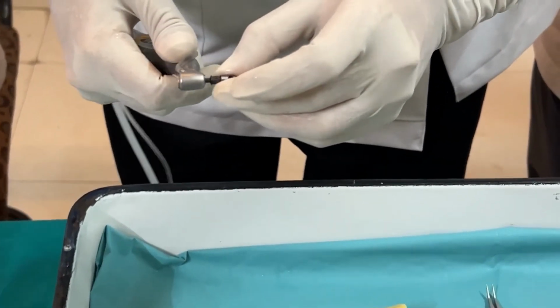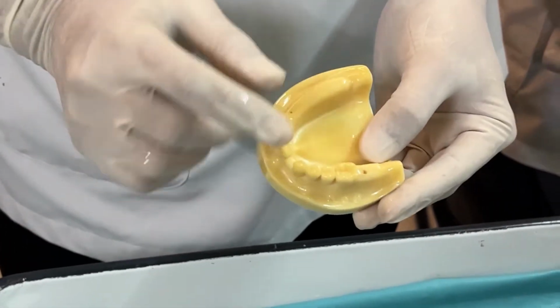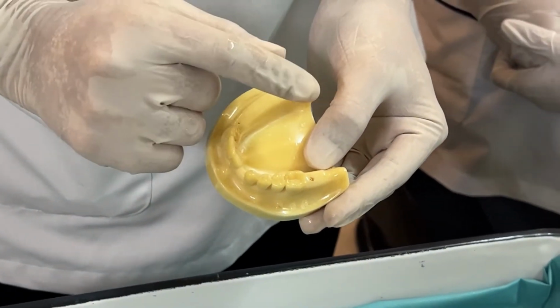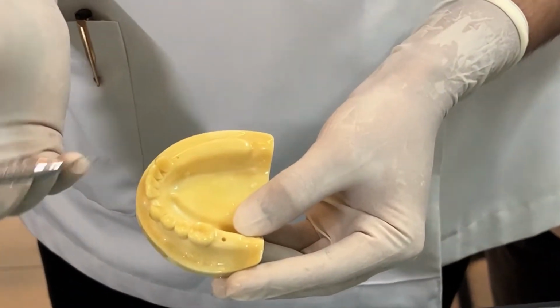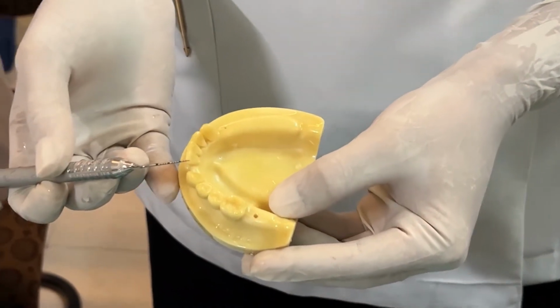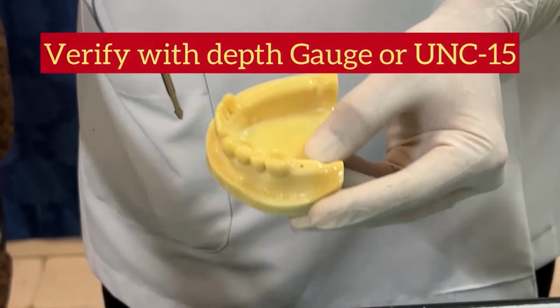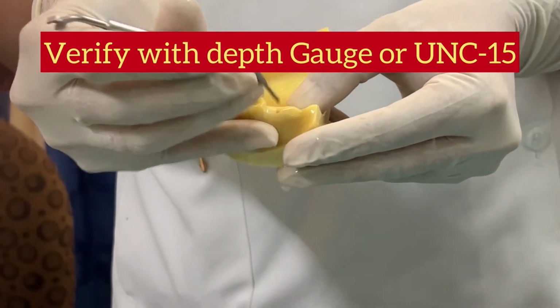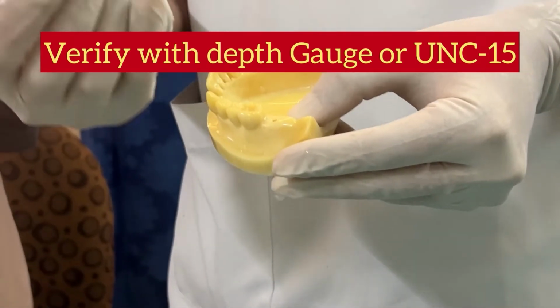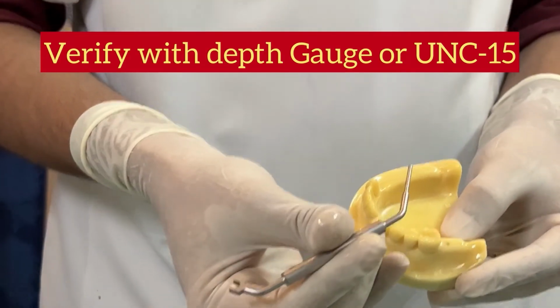So once you have made the initial depth, since I told that the remaining drills are only and only side cutting, always and always verify the initial depth with the 2 millimeter or 2.4. For that you can use a depth gauge also. Many a times the depth gauge would be too wide to go into these initial osteotomy sites. The depth gauge is good enough once the osteotomy is fully prepared.